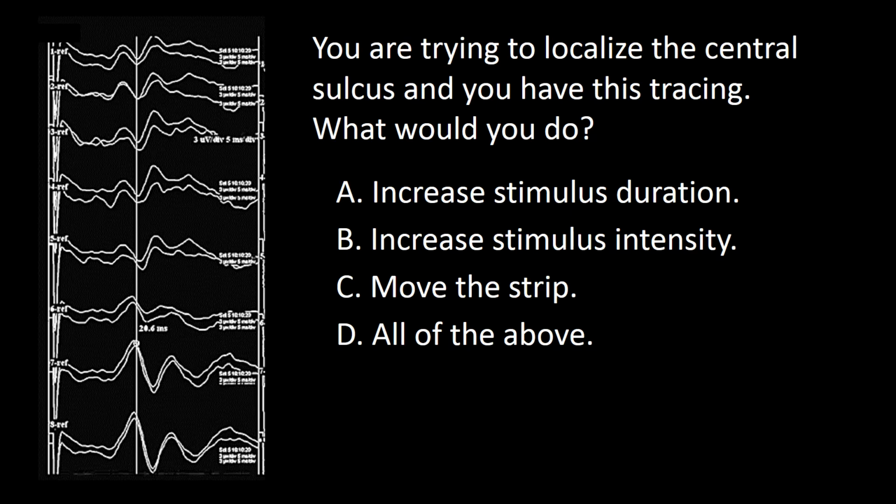Next question. You are trying to localize the central sulcus and you have this tracing. What would you do? A. Increase stimulus duration. B. Increase stimulus intensity. C. Move the strip. D. All of the above.